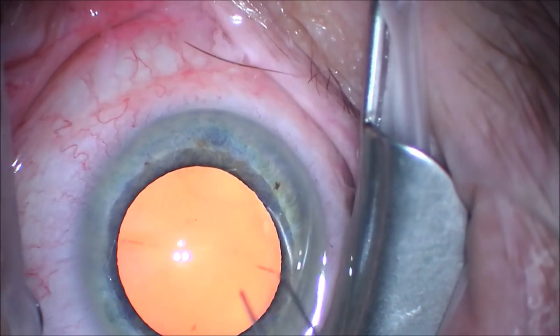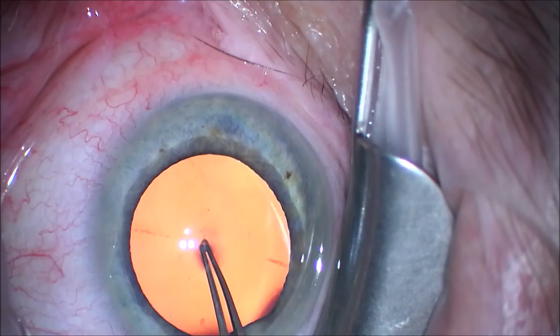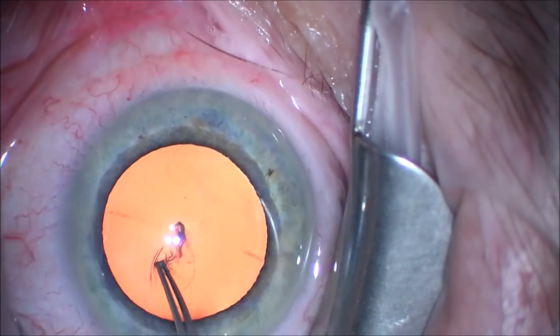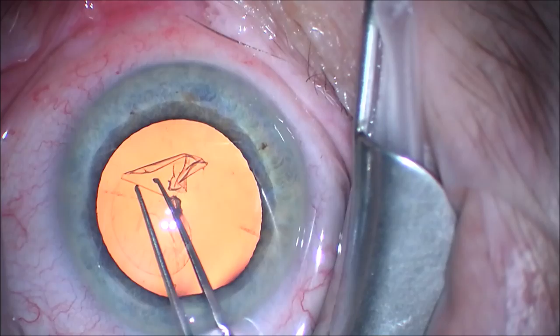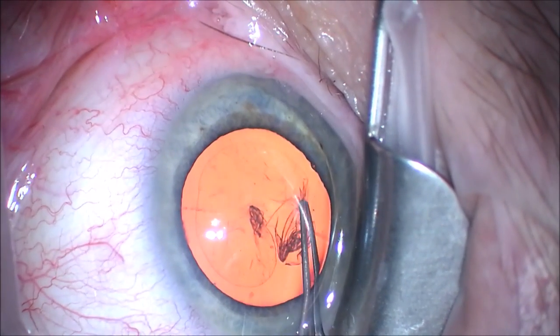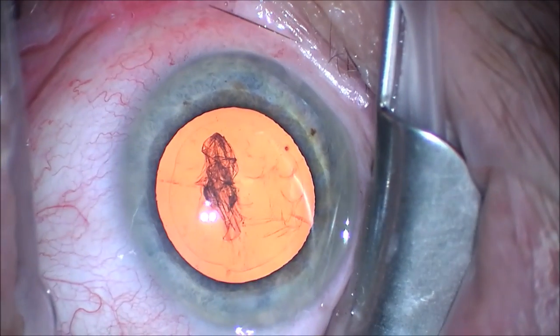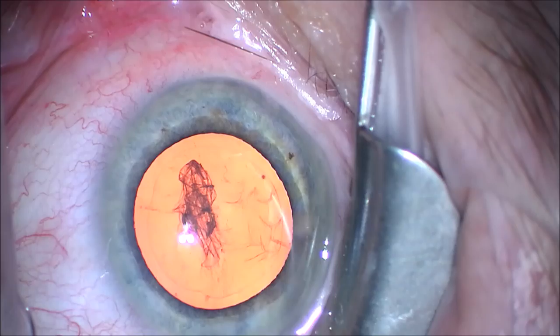We perform our typical capsulorrhexis, trying to keep it approximately 5 mm, so we can completely surround the anterior surface of the Symphony intraocular lens with the anterior capsule. After the capsulorrhexis is completed, we move to the next step.